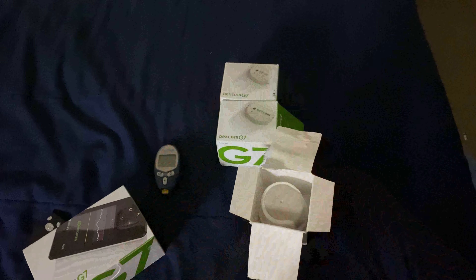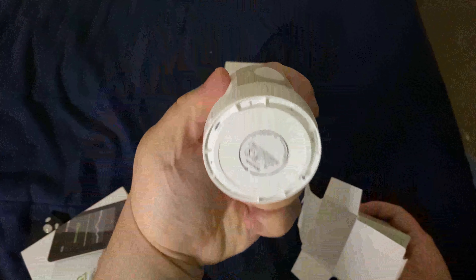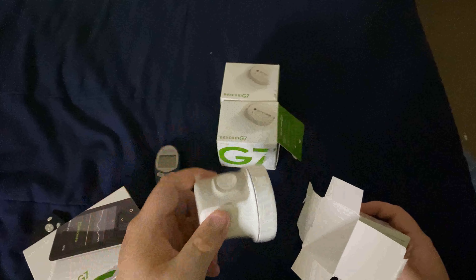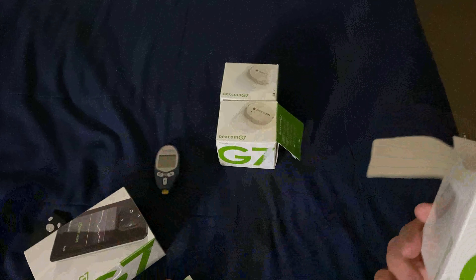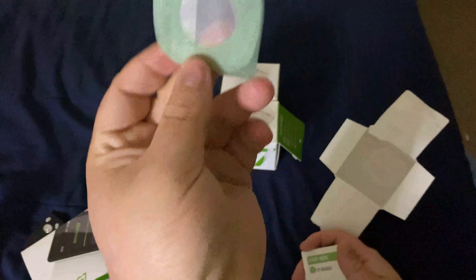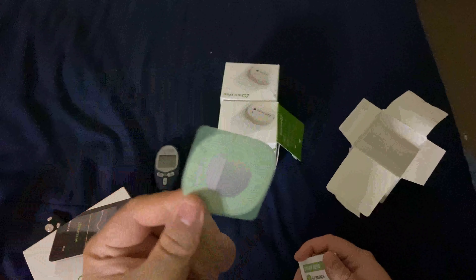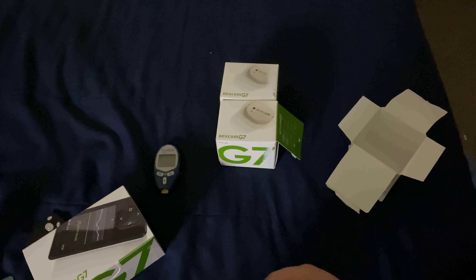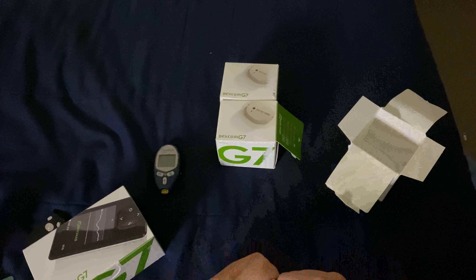I wanted to show you guys the full details of what's inside of the box. Inside the box, you would get the pad, of course, the instructions, and also this little injector — you can put it on your stomach, the back of your butt cheeks, upper arms, or the shoulder, whatever gives you a particular reading. So that comes in this box here. If you pull up this pad, this is the pad to seal it tight, and I'll show you guys how to put it on your skin.